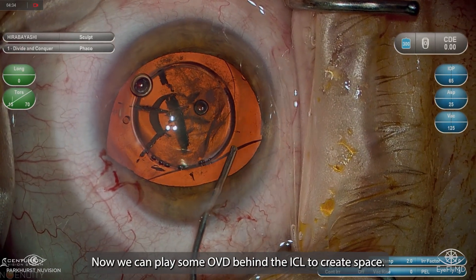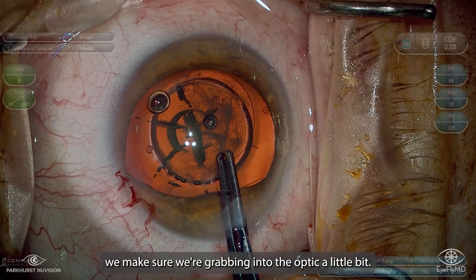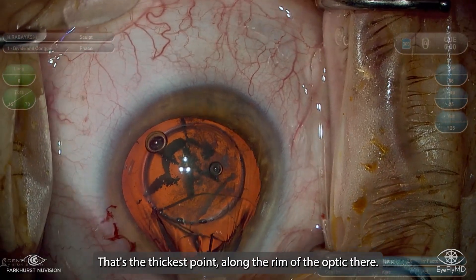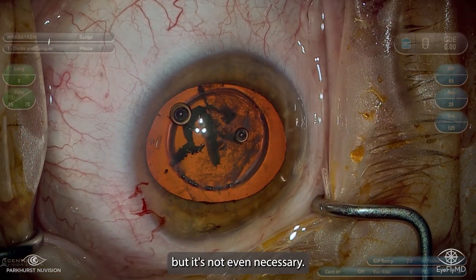So now we can place some OVD behind the ICL to create space. And now when we grab it, we make sure we're grabbing into the optic a little bit — that's the thickest point along the rim of the optic there. You can do a hand-over-hand technique here, but it's not even necessary sometimes.